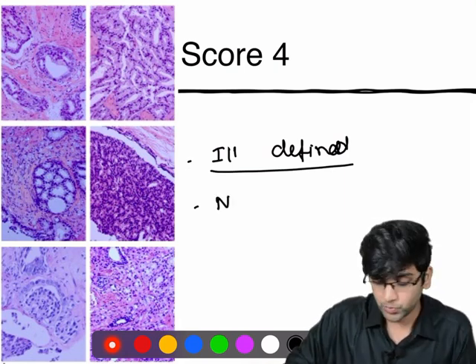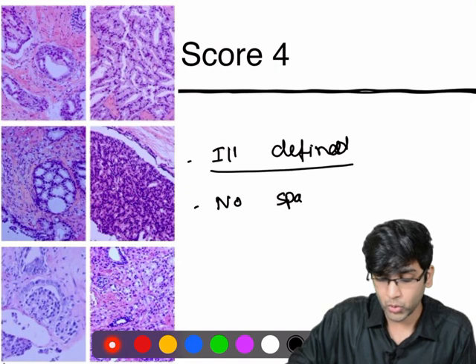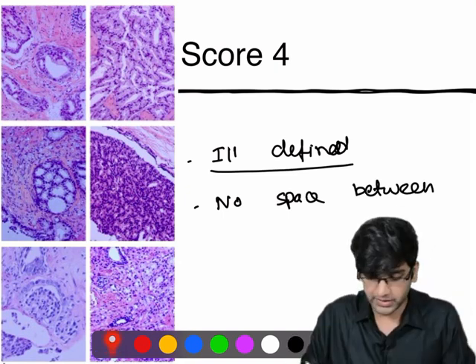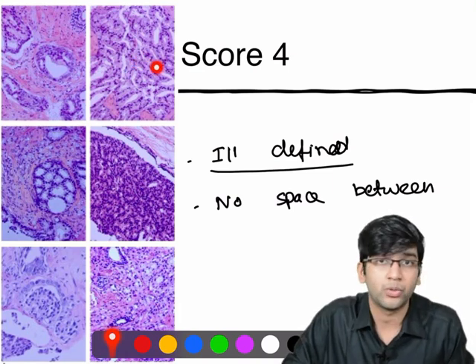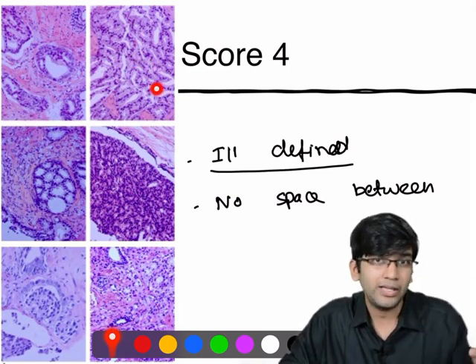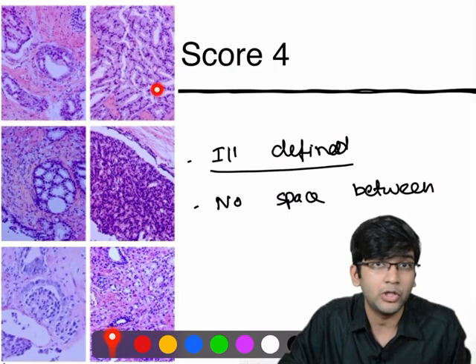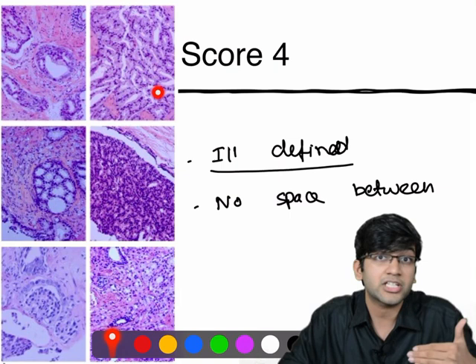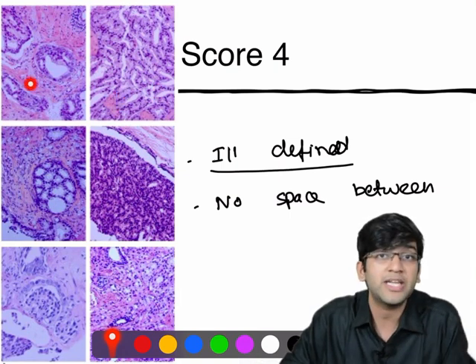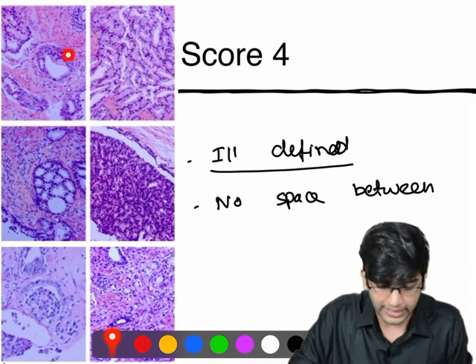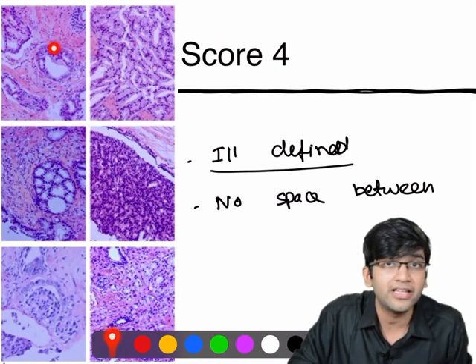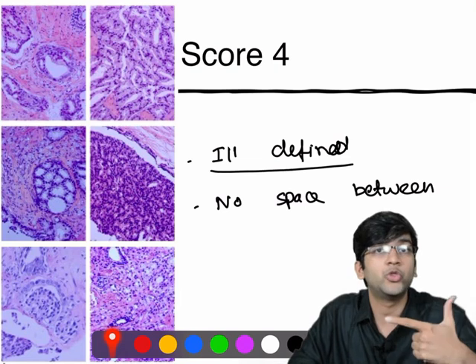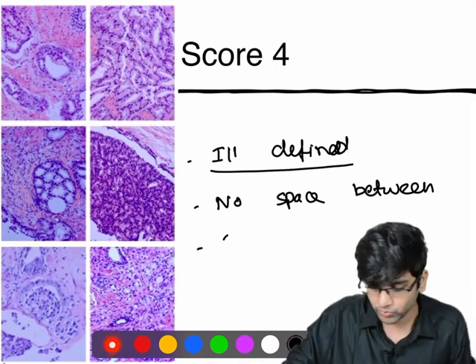The second feature for score four is when the glands have no intervening space between them. The glands may be well-formed, but there's no space between them. For example, looking at this picture, you can see a well-formed gland with a perfectly normal lumen, but these glands are juxtaposed with each other — there's no well-defined space between them. So ill-defined glands or glands with no space between them are features of score four.